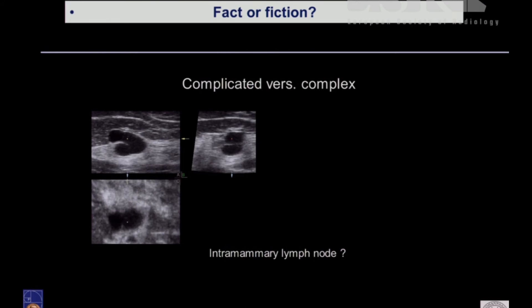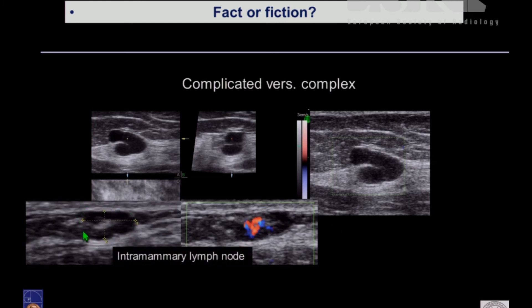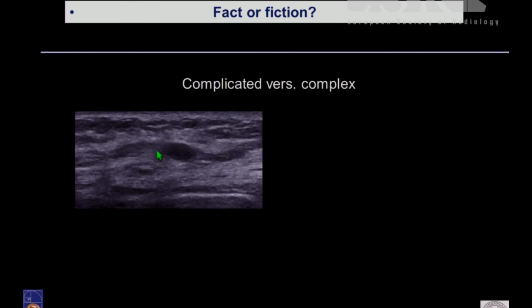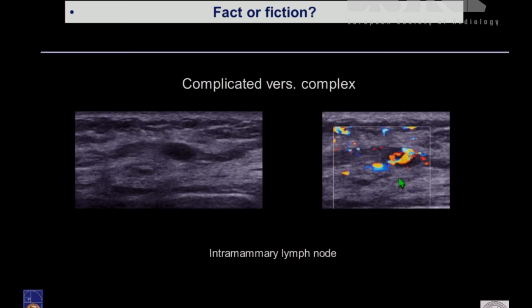Complicated cyst versus complex cyst. What's this? Is it an intramammary lymph node, or is it a cyst with a thin septum? Go for color Doppler — you see there's no vascularization. An intramammary lymph node shows vascularization with hilum vessels. Compare: this is an intramammary lymph node and you see the vessels in the hilum. Even in very small lymph nodes, you can visualize the vascularization of the hilum vessels. Another example on color Doppler — it is nothing else than an intramammary lymph node. Lymph nodes sometimes are very echo-poor, and the discussion may arise whether this is a complicated cyst or maybe a complex cyst.